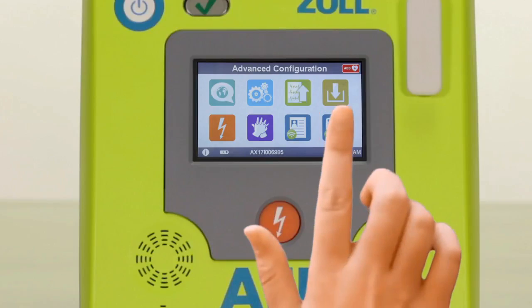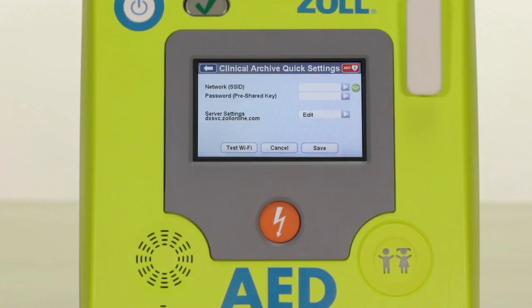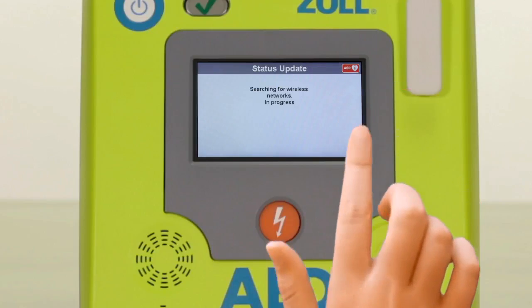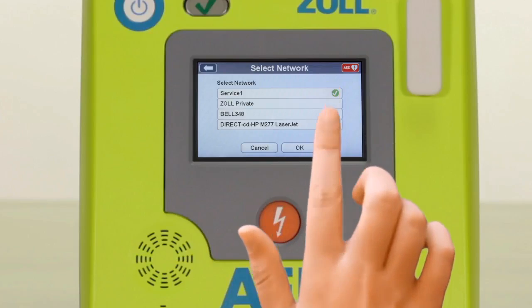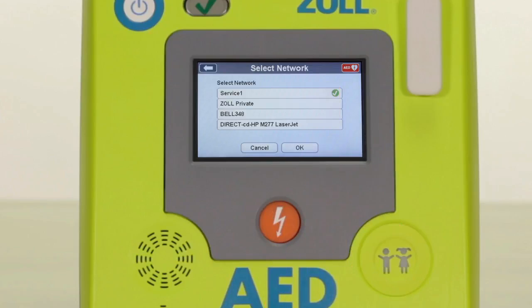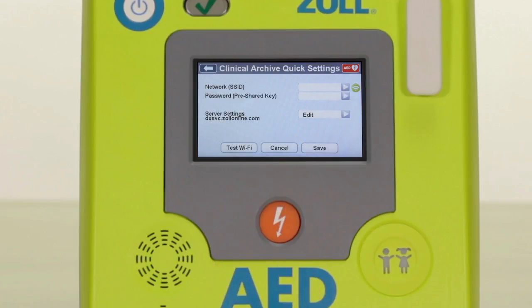As with transmitting case data over Wi-Fi, you will need to identify and select your network and enter a valid password. Test your Wi-Fi connection to ensure that you have proper connectivity. You should not change the server settings on your AED3 — this has been pre-configured at the factory or by the distributor you purchased your AED3 from, to send your AED3 readiness data to the appropriate server.